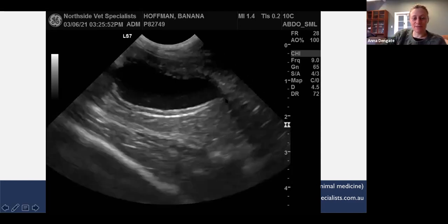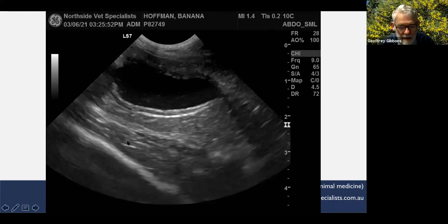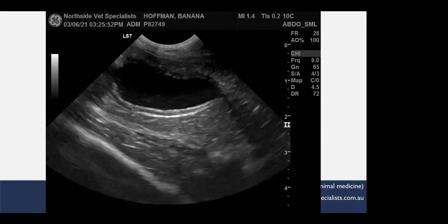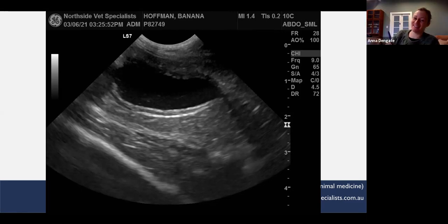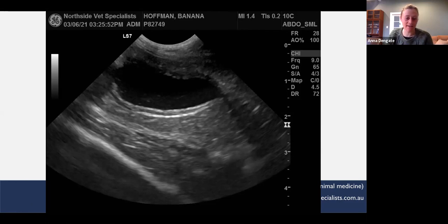Good. What about this gallbladder? The wall looks hyperechoic and thickened. Good. Layered. Good, double wall. Yeah, I agree. It's layered as well. What does that mean? The dog's got heart disease. It's one of the differentials. It's got edema of the gallbladder wall. Good. Excellent. So when you see that double layer, the halo sign, it means that there's fluid in the gallbladder wall.